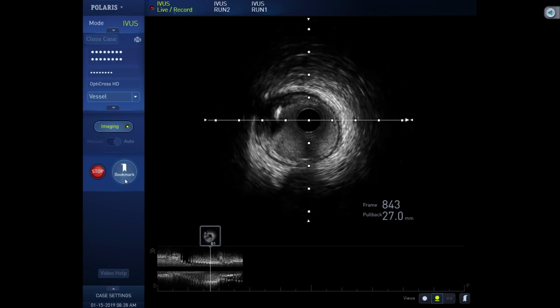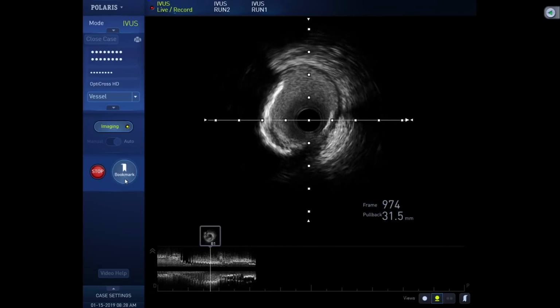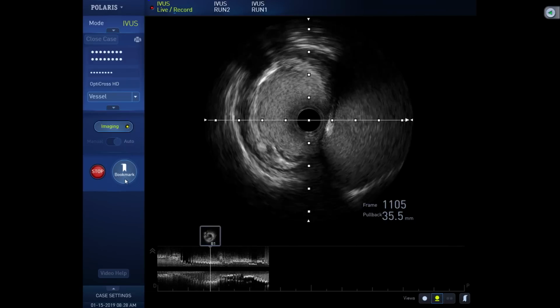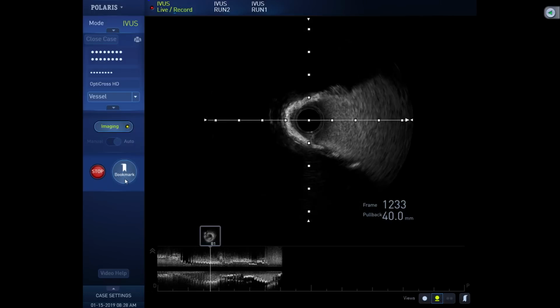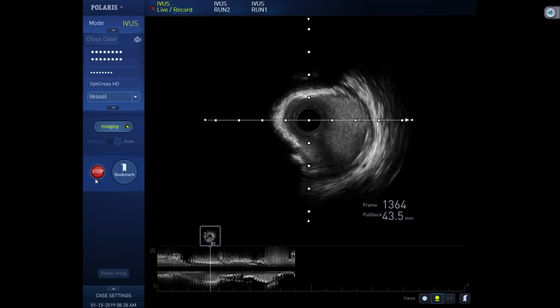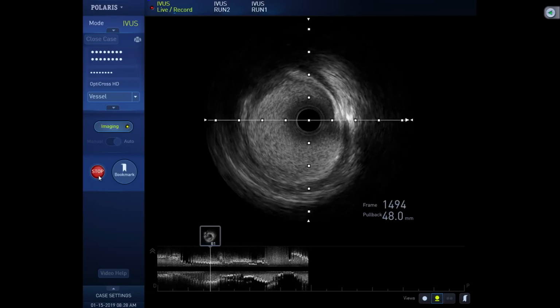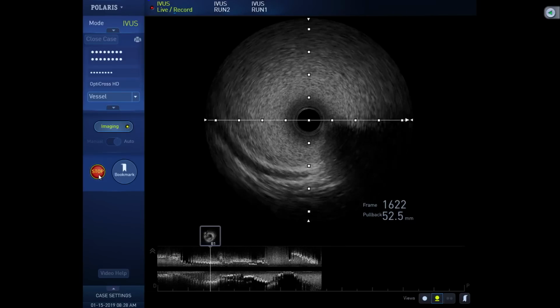Can you see the aneurysm? That's the aneurysm, right? And then we are coming towards the... No, the aneurysm has not come here. There you go. This is it. So it's actually at the distal part of the left main, distal left main, heavily calcified. A 360-degree arc of calcium. Maybe that's the reason we did not get into the circ. Okay, we can stop.